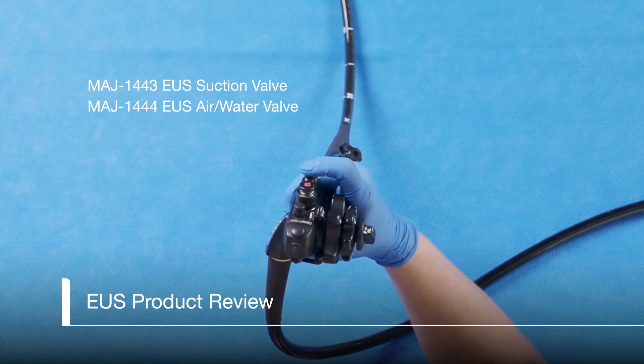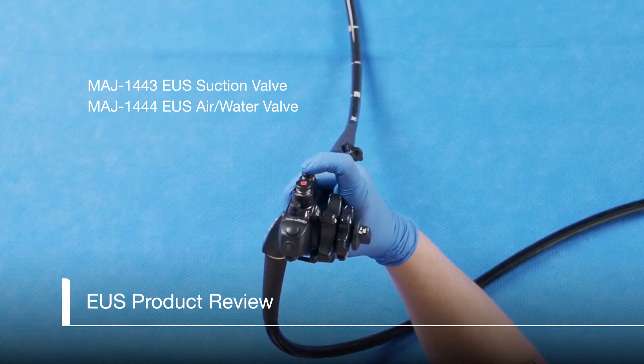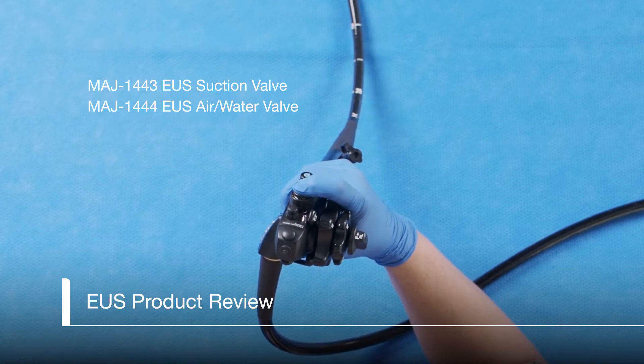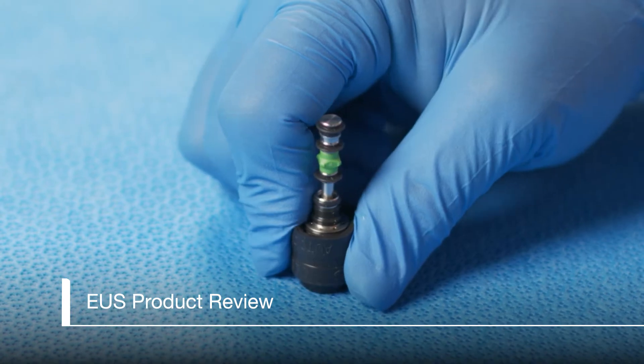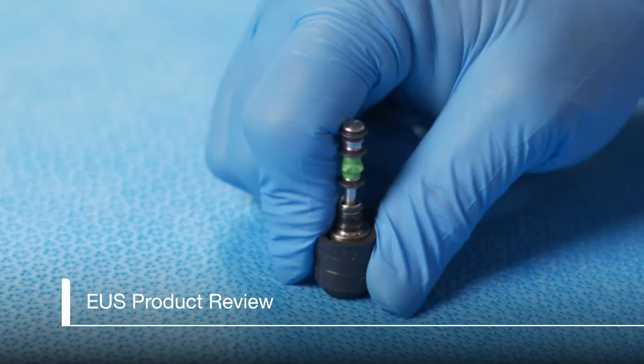EUS valves are two-stage valves. Often when the valves are new, they need to be primed. We can do this by pressing the valve button completely down several times to confirm it moves smoothly. If the button is difficult to press completely down to the second stage, turn it upside down and press it firmly down on a hard surface.